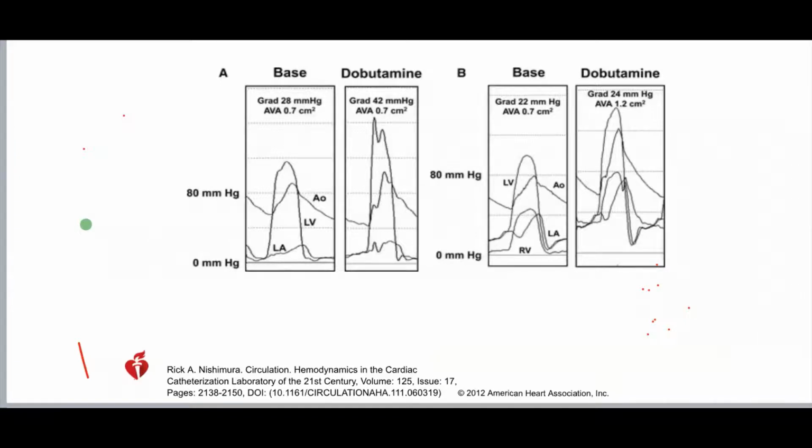Yeah, but that's just artifact because the catheter position and being side hole or end hole has a lot to do with the crisp signal of the hemodynamics. It has a lot to do. That's why we have a lot of artifacts, by the way, in the invasive hemodynamics, and you have to make sure that you are obtaining it right, and you are using the right catheter, and you are positioning it fixed in the place, and all of that. Okay. But this is a good observation.